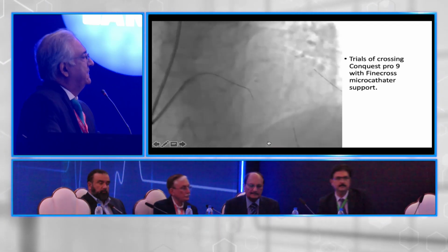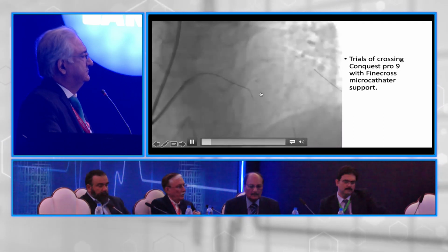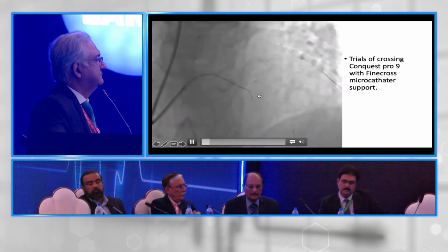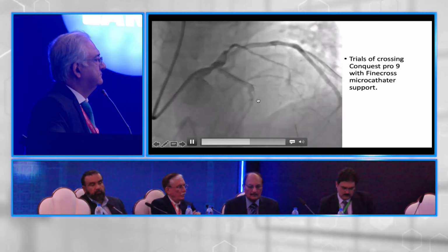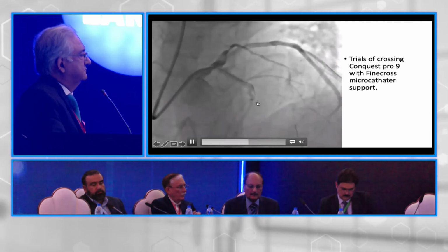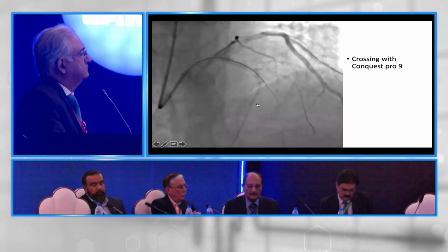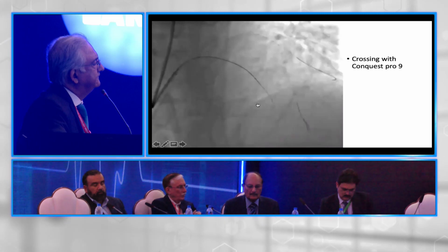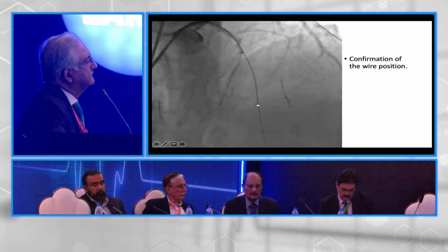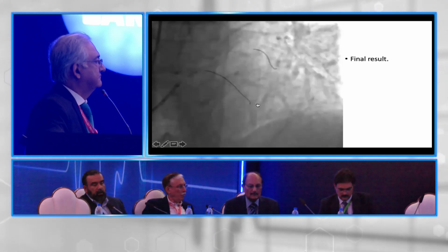Yeah, okay. And here, I first thought the proximal cap was here, but when I tried to wire it, my wire went along this vessel. So then I realized that the proximal cap is here, and I pulled back and redirected. This is also a Gaia Conquest Pro, and it crossed the lesion. So after stenting, the LAD looks like that.